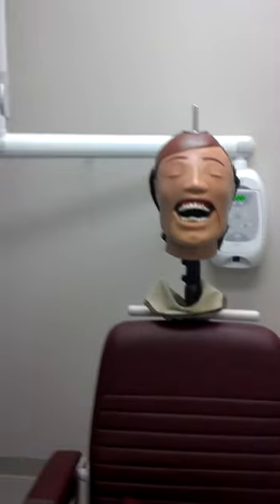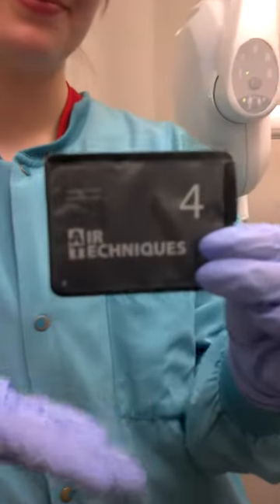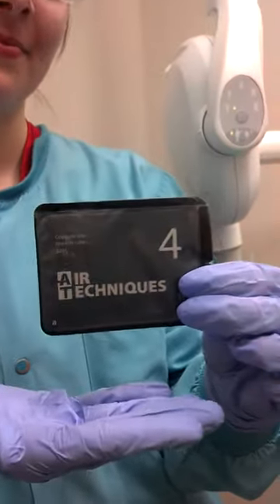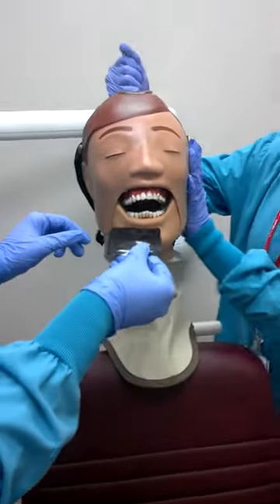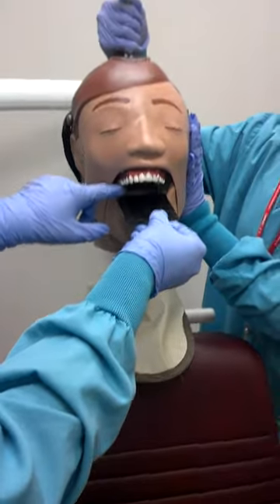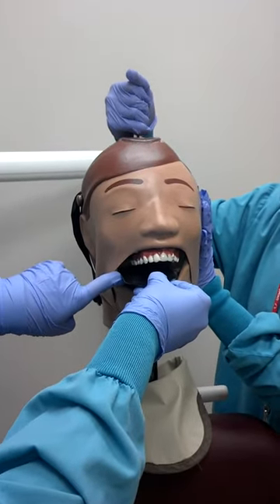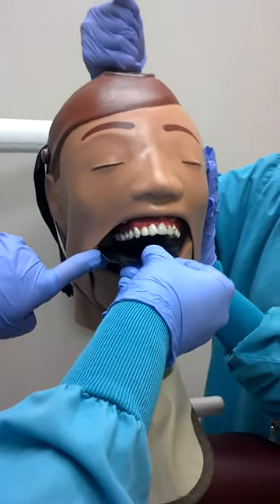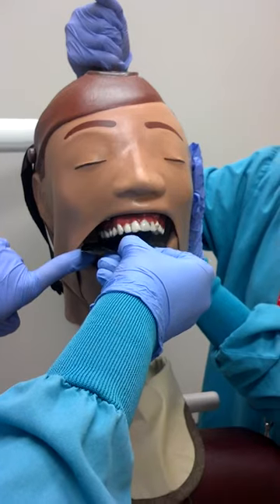You are now ready to take the radiograph. Make sure you have a size 4 phosphor plate. Take the long axis of the plate parallel to the facial surface of the posterior teeth. Move the plate to the right so that there is half an inch of the plate on the buccal side. You would move it to the left if you are on the left side of the mouth.